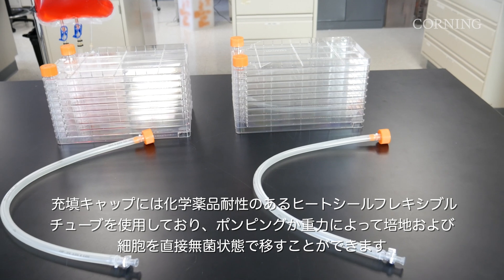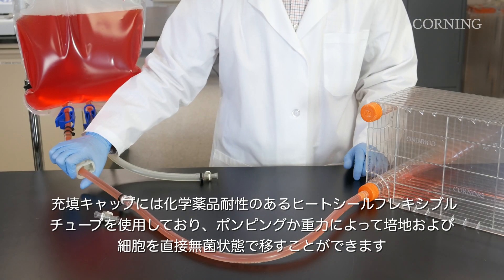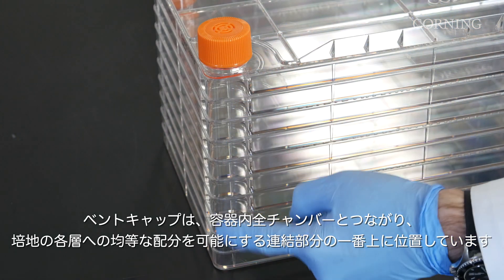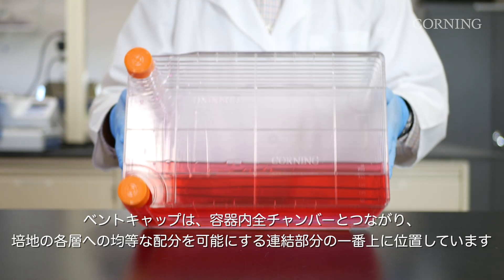Filling caps are available with chemically resistant, heat-sealable flexible tubing to allow direct sterile transfer of media and cells via pumping or gravity. The vented caps sit on a manifold that allows access to all chambers of the vessel where media equilibration occurs.